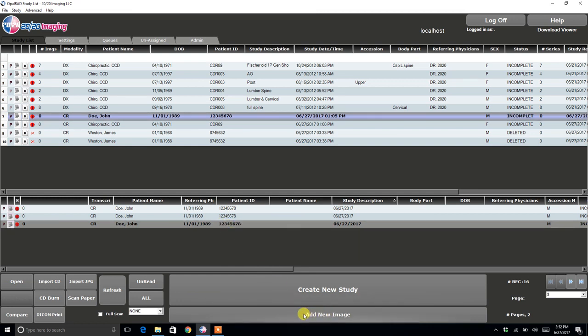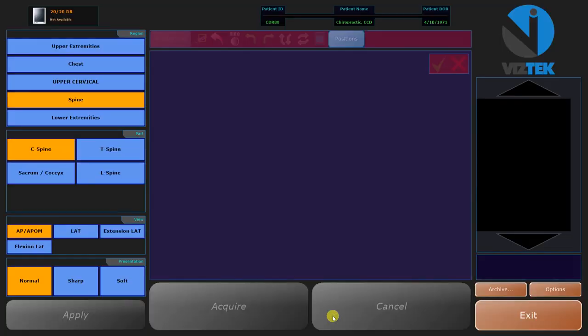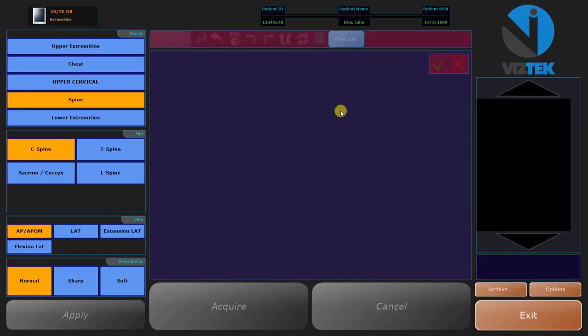Study selected. Click Add New Image, and then it brings you back into the Acquire to add images into the new study.